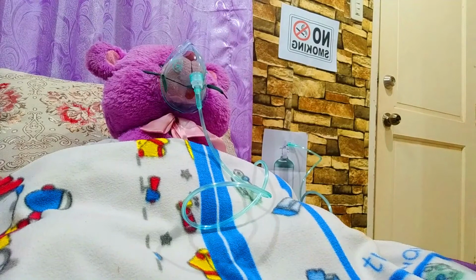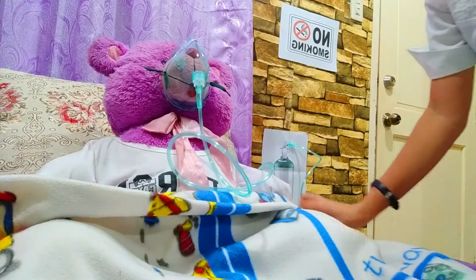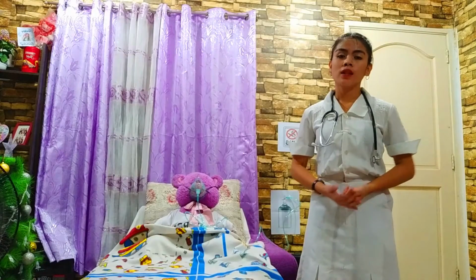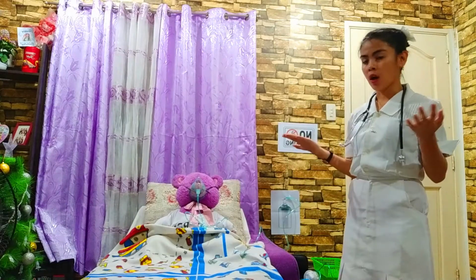And we need to stay with the patient for a time to observe the response to treatment. And then we need to remove the mask every 2 to 4 hours and wipe away the accumulated mist and assess the underlying skin. And then we need to discard the used equipment appropriately and wash our hands.